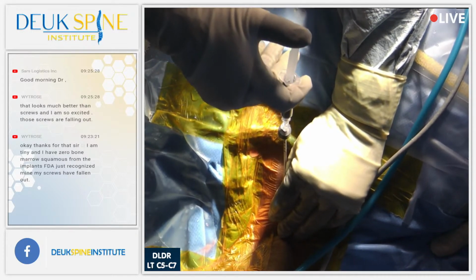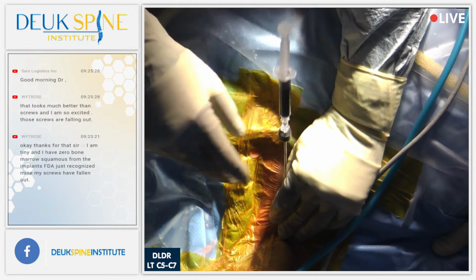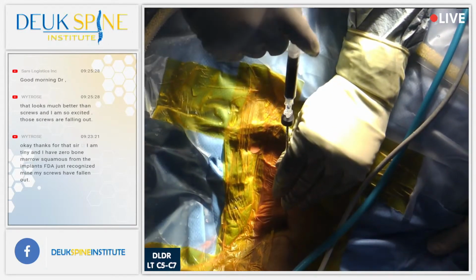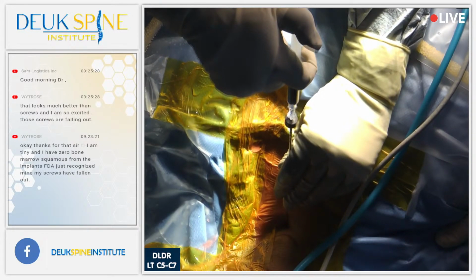Not bad. When I can't stick it in the hole, you know it's time for me to retire. Shot. All right, we need a little more shoulder pull, guys. A little more shoulder. There it is. Oh, you can actually see the herniation. Show us the herniation. Shot.